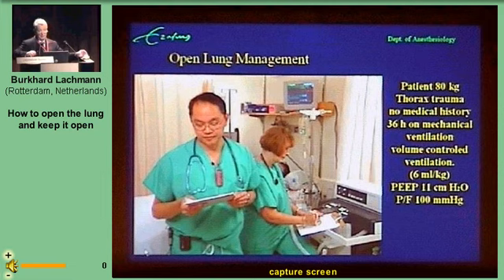Okay, that's good. We gave that over about an hour, and that was finished at 10 in the morning. Since then, we've challenged him with a PEEP of 20, and he tolerated it well this time. His blood pressure dropped a little to about 118/85, and then we backed off on the PEEP to 11. And we've been holding there until I could get a hold of you.